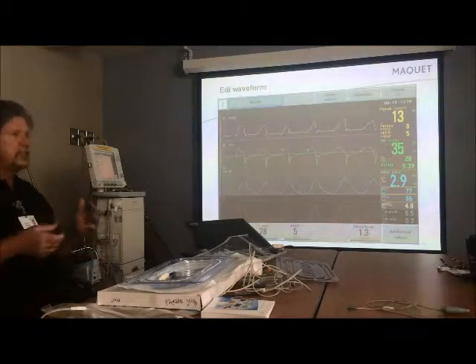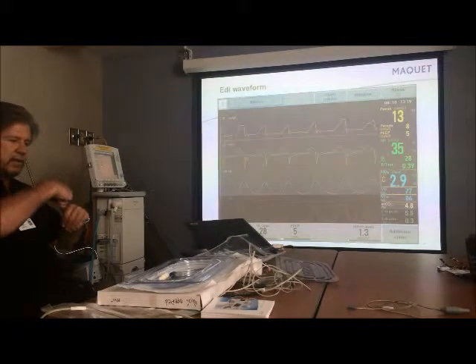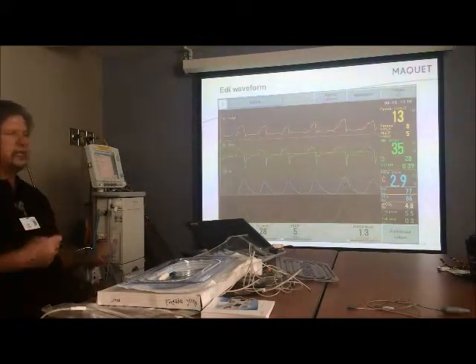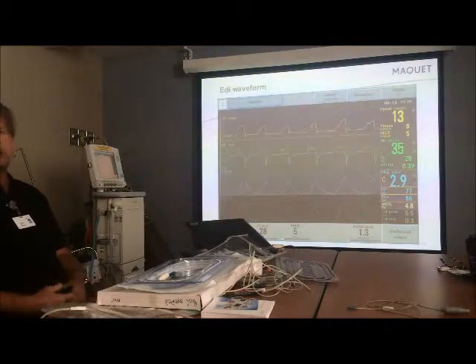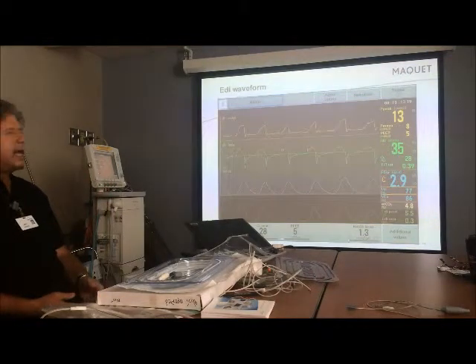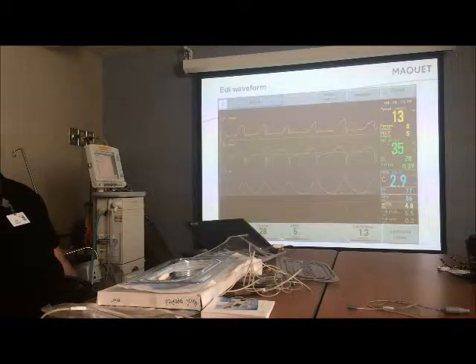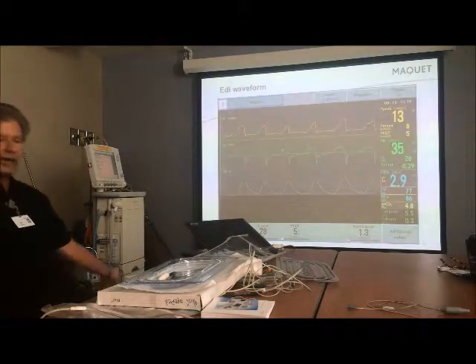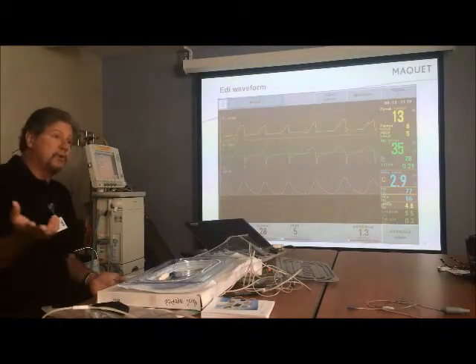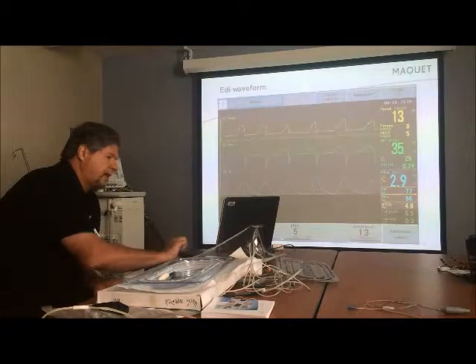The pressure is being created commensurate with the way this is going. So that illustrates how the ventilator is actually following the depolarization of the diaphragm to deliver flow and pressure consistent with the way the brain intended the flow and pressure to be delivered. And that's the perfect flow synchrony. And that's what causes the patient to go, I can relax. I can sleep better, and there are studies that show that sleep is improved while you're on NAVA, and that's important for babies as well.